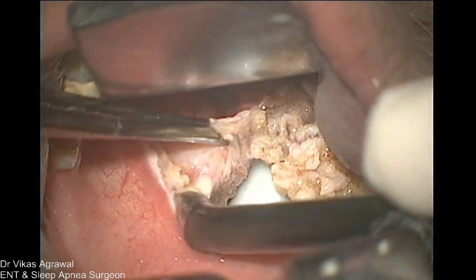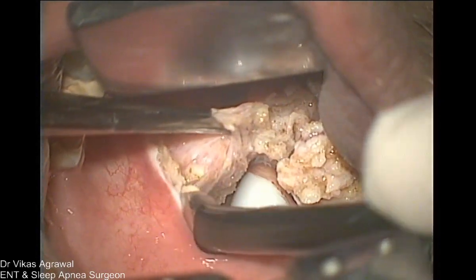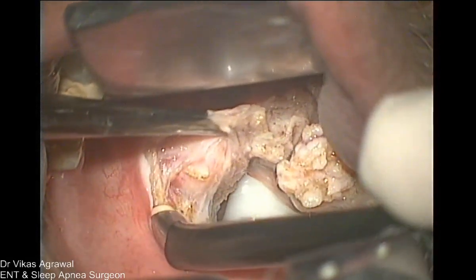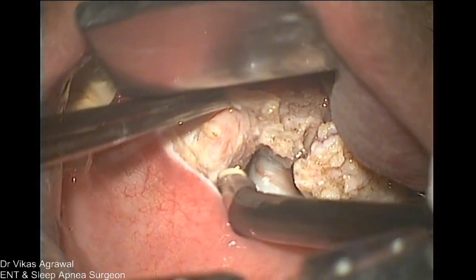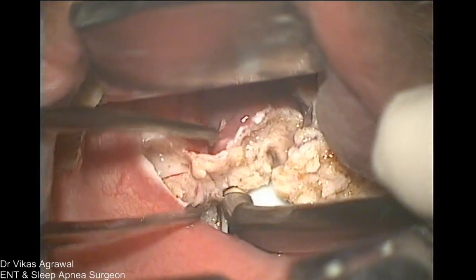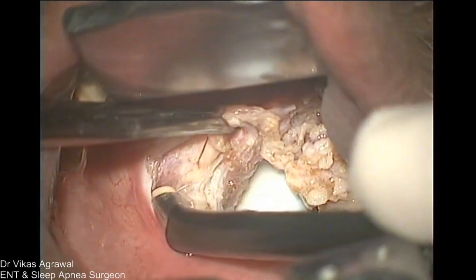We'll pick up the tonsil. See, as we anticipated, the tonsil is going endophytic inside. We have to pull the tonsil out. See, it's going there.